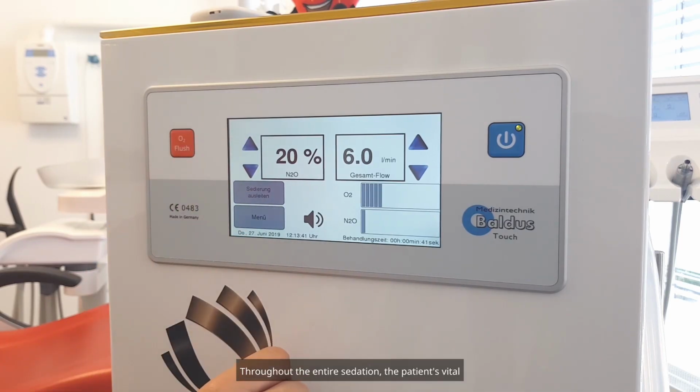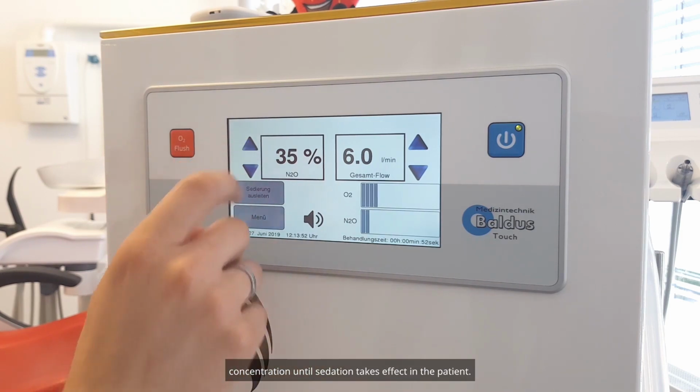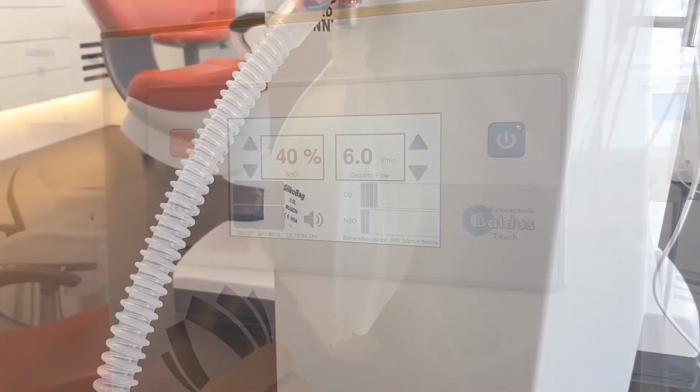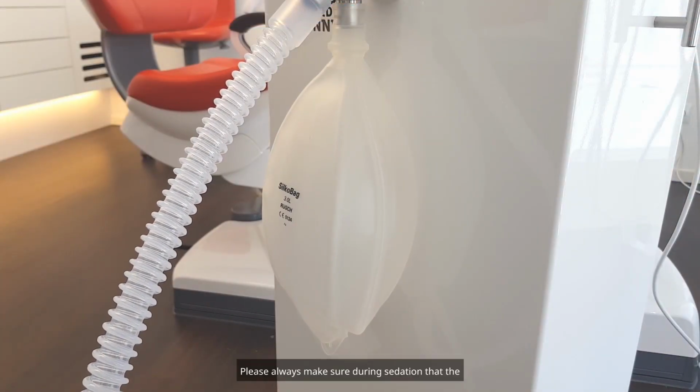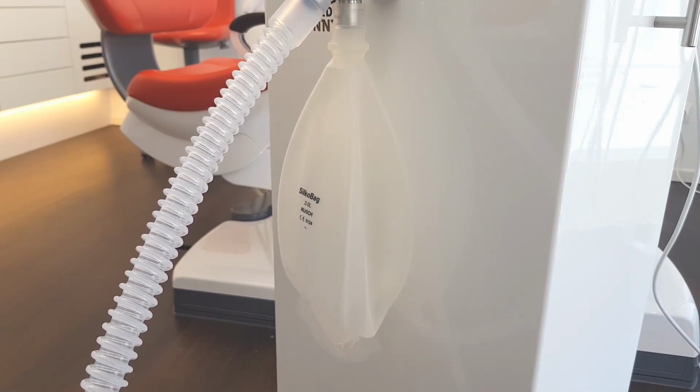Throughout the entire sedation, the patient's vital signs must be monitored using our pulse oximeter. Now we can gradually increase the nitrous oxide concentration until sedation takes effect in the patient. Please always make sure during sedation that the breathing bag is filled with enough gas mixture.